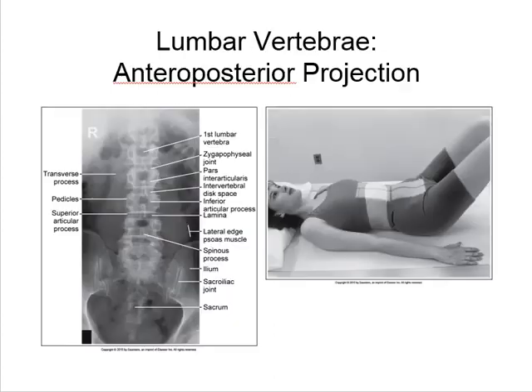So keep in mind that if your doctor, your radiologist, calls for a KUB instead of an AP of the L spine on an L spine series, remember it's him who sets the protocol primarily. If he wants a KUB instead of an AP L spine, there are some very valid reasons for that.